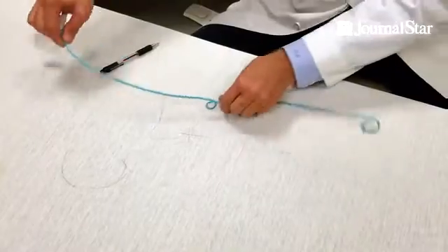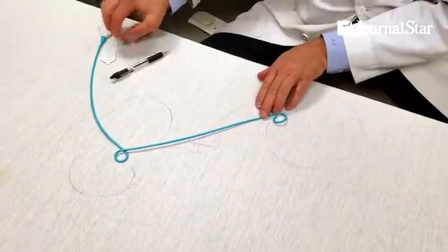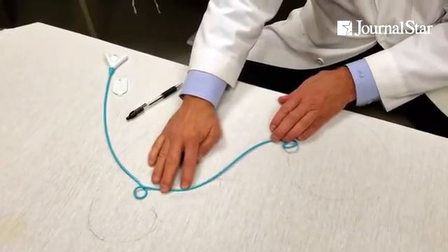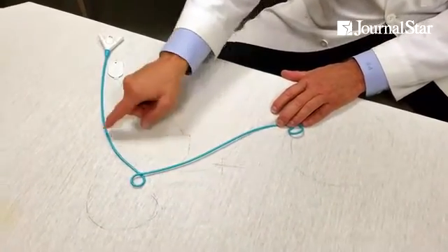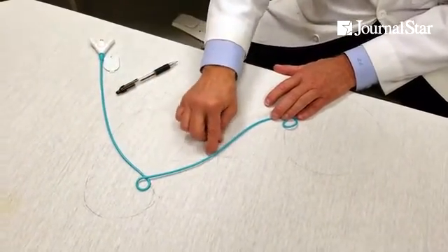This device goes in like this and connects the two. That's why you have a pigtail here and a pigtail here — so it doesn't move. It stays in there and goes across, connecting the kidney to the bladder, allowing internal drainage. This is a hollow tube with side holes.